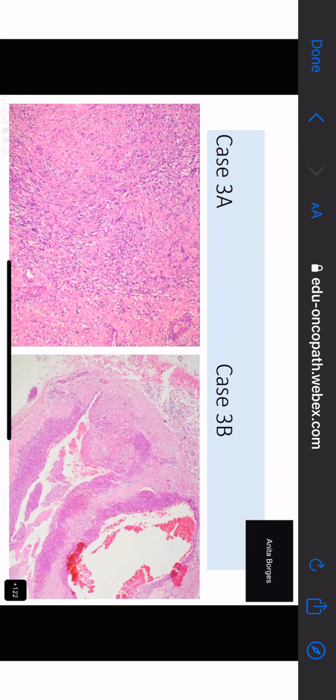Okay, so you have got fascicles. Maybe there's a little bit of a herringbone pattern over there. But you were absolutely right. There are areas which have got clear cells and others that are frankly spindle. On the right hand side, you see something else. And what is that? There is a condensation of cellularity around that lumen, ma'am. Around the spaces. Spaces filled with blood. Very good.